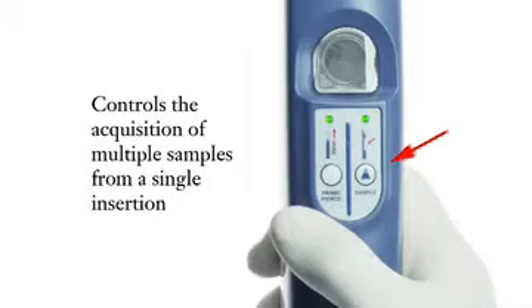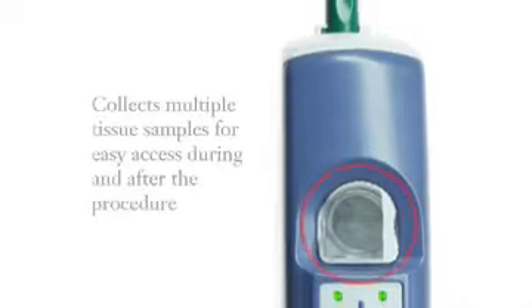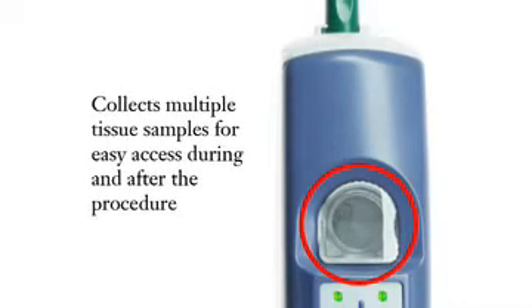The Finesse Ultra breast biopsy system is a simple two-button operation. One button controls the acquisition of multiple samples from a single insertion, while the other button controls the optional piercing mode, which can be used to penetrate dense tissue. The sample container collects multiple tissue samples for easy access during and after the procedure.